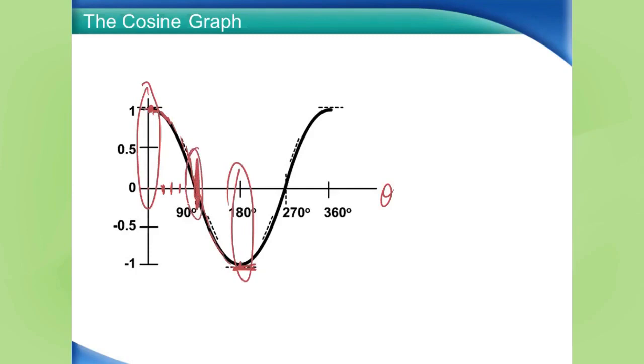Okay? So hopefully this makes it clear to you that the cosine has a very nonlinear behavior, meaning a 10-degree error around 0 is not the same as a 10-degree error around 60 degrees, which is not the same as a 10-degree error around 180 degrees. It varies as the angle gets bigger and bigger. All right. So now we're going to learn about the Doppler effect, and then we're going to put the pieces together.